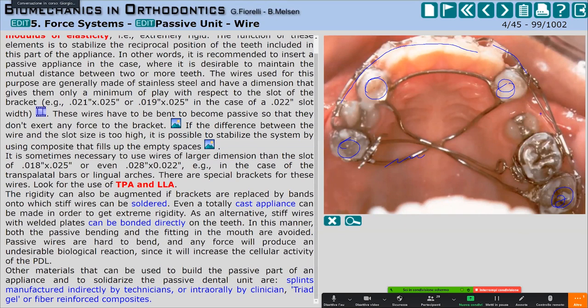And basically, I was having a reactive unit that consisted of all these teeth plus this, and my active unit was this tooth here. Okay. So this was something that we were using very much before the TADs era. I mean, once the skeletal anchorage was available, I think the need for such solutions has decreased, but sometimes I'm still using this approach.